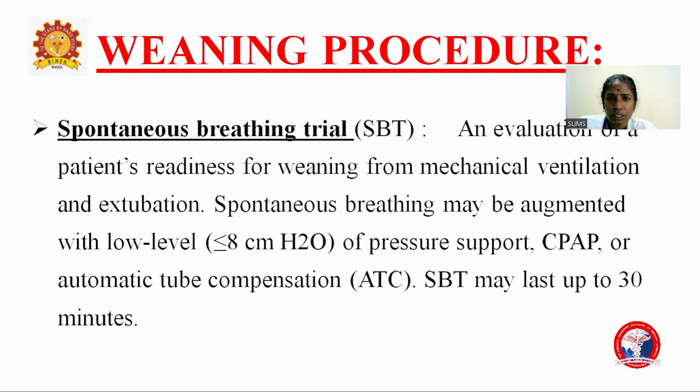So here the patient is ready for weaning from mechanical ventilation and then for extubation. This is the spontaneous breathing trial. The spontaneous breathing may be augmented with a low level, less than 8 centimeters of water, of pressure support, CPAP, or automatic tube compensation.